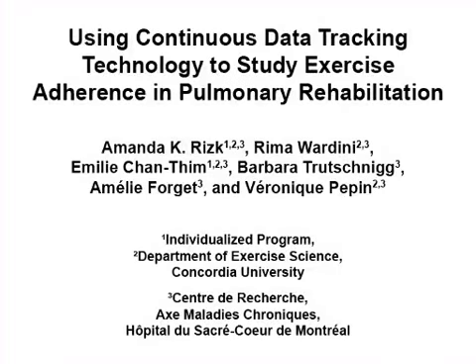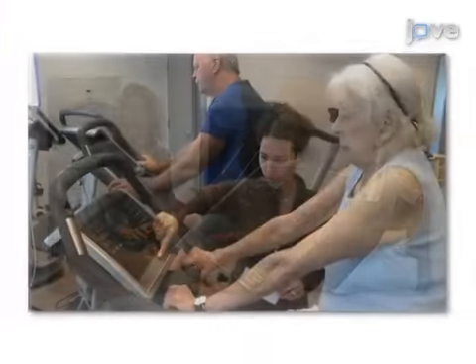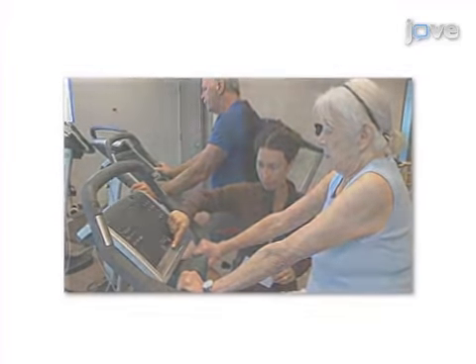The overall goal of the following protocol is to describe how continuous data tracking technology can be used to precisely measure adherence to a prescribed aerobic training intensity. This is achieved by first collecting the data using continuous data tracking technology during an aerobic exercise training session.